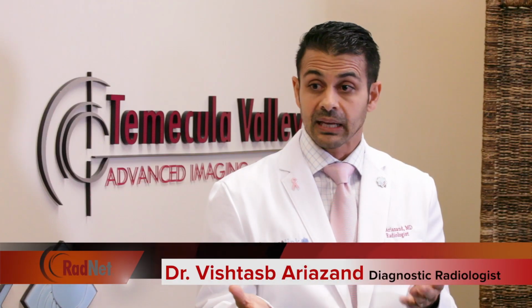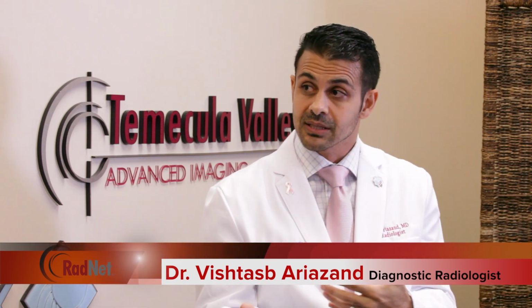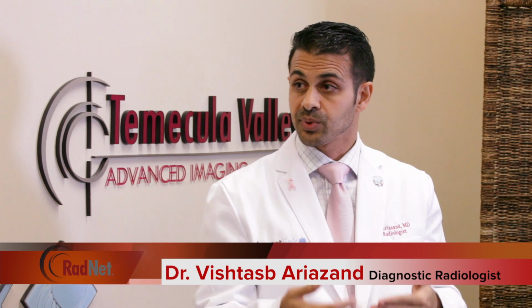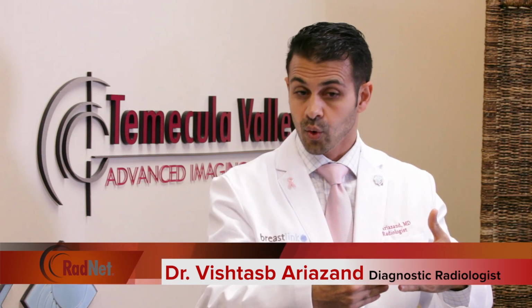Correct. Unfortunately, depending on where the implant is placed, it will dictate how much of the breast tissue you can see. Because they can place the implant in front of the pectoral muscle, or they can place the implant behind the pectoral muscle. If it's behind the pectoral muscle, that's when we're able to see the majority of the breast tissue. And the way that they put the implant in, either in front or behind the muscle, how does that affect it?